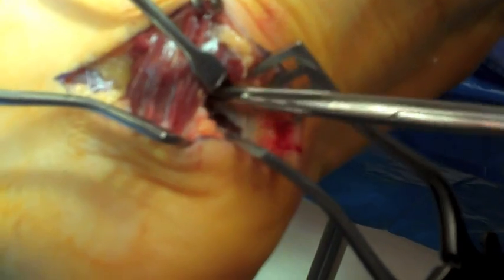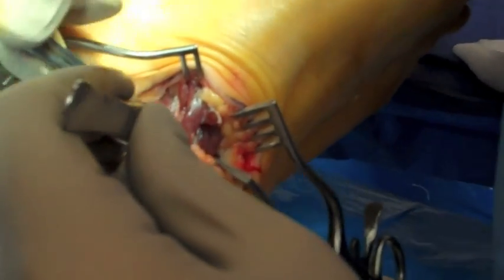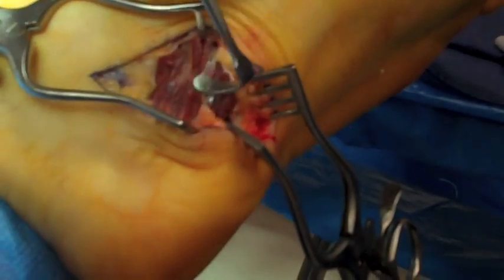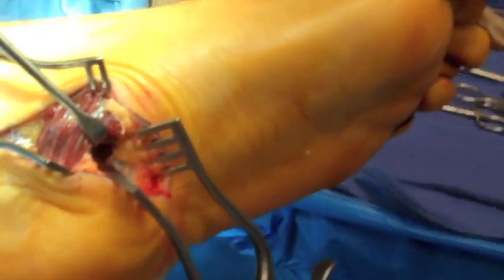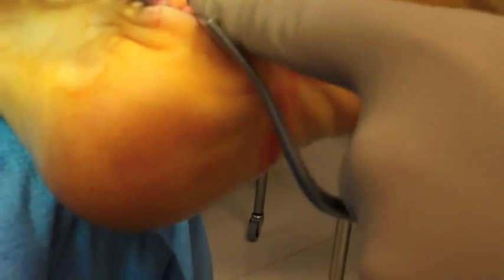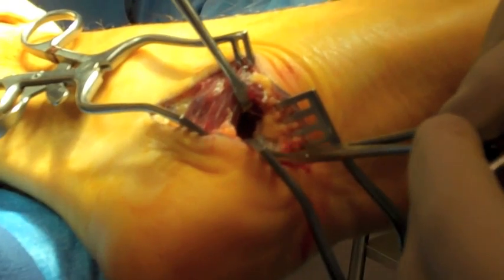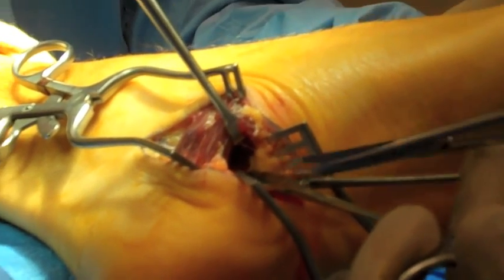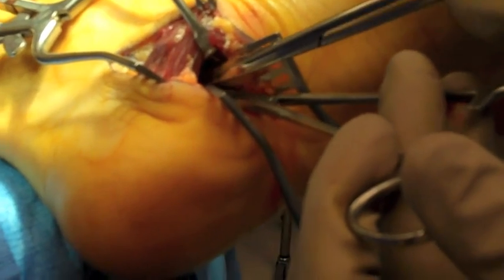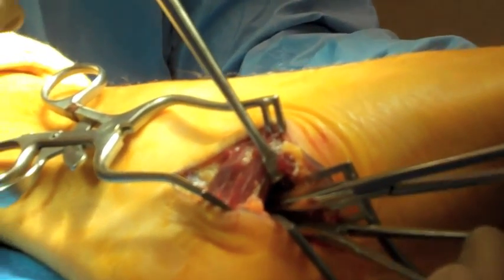Blunt dissection is used at all times in order to protect the underlying neurovascular structures and additionally to prevent muscle injury. Sometimes it is helpful to re-identify the correct level from the dorsal aspect where the previous release had been performed to help locate the proper plantar entry point. Once the deep fascia is visualized, a hemostat is used to elevate it from the underlying neurovascular structures. The deep fascia is then released with Metzenbaum scissors to join the previous release from the dorsal, or cephalad, surface. This should be a complete release with no constricting tissue overlying the neurovascular structures in this area.